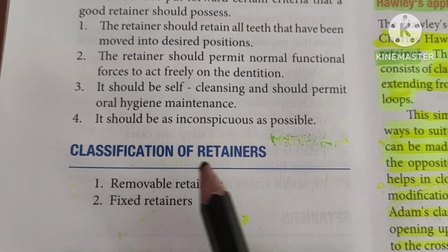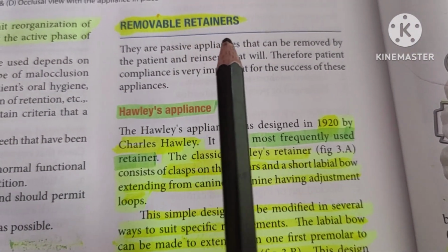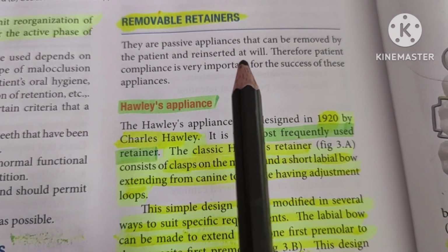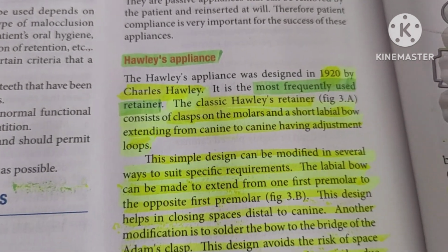Okay, so now let's talk about the retainers. They are removable retainers and fixed retainers. First we'll talk about the removable retainers. Removable retainers are passive appliances that can be removed by the patient and reinserted at will. Therefore, patient compliance is very important for the success of this appliance.